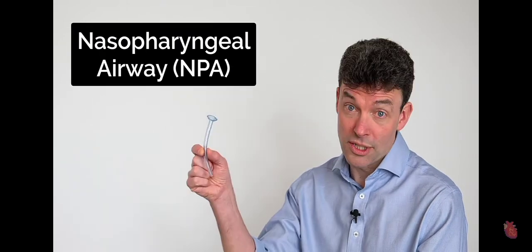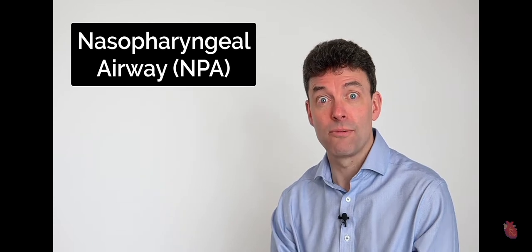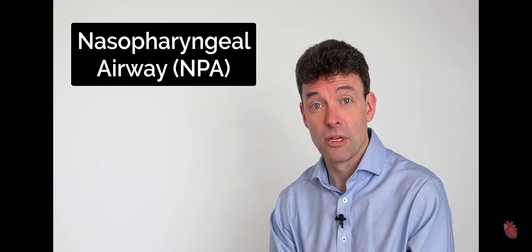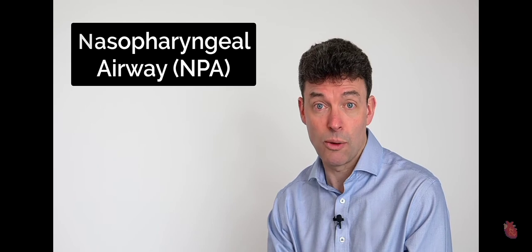Hello, my name is James, and today we're going to be talking about the nasopharyngeal airway. That's one of these tubes. It's really essential that you understand how this works, because it can be of vital importance if you're managing a patient who has difficulties with their airway. I'm going to explain a bit about it, a bit about the indications for using it, and then I'm going to demonstrate on a model how we put it in.